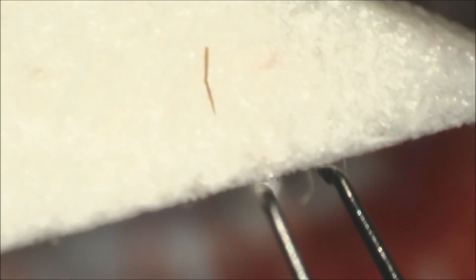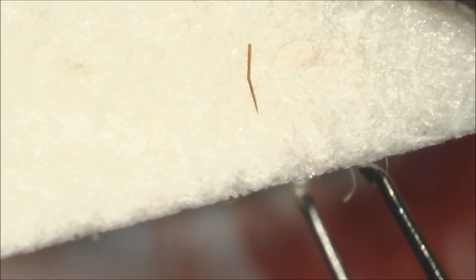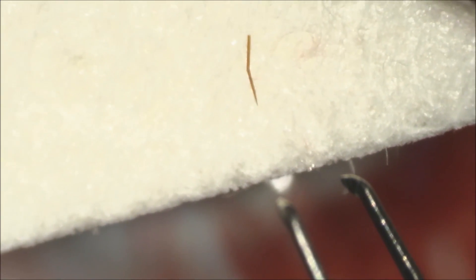At higher magnification, you can see the intact bee stinger on the clear Weck-cell sponge.